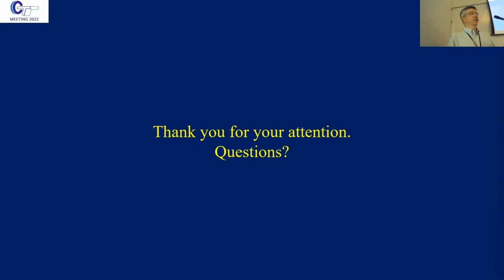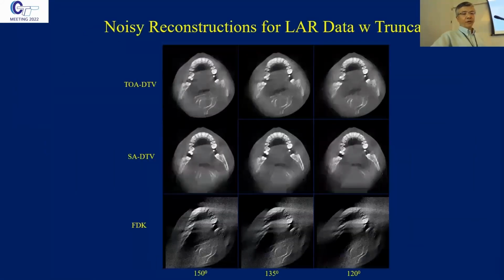We don't have a detailed mathematical, analytical guidance, because I think it's going to be very difficult, very complicated, because we're dealing with a DD model. And also it has to be object dependent, the anatomy arrangement. So for this case, the single arc case, if you go from here, you can lose some information, it's not the best trajectory.